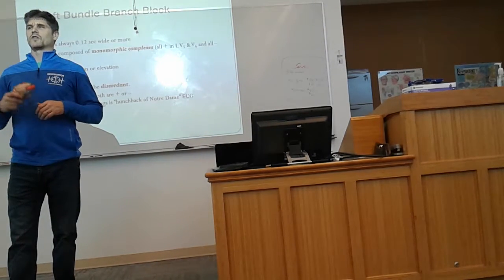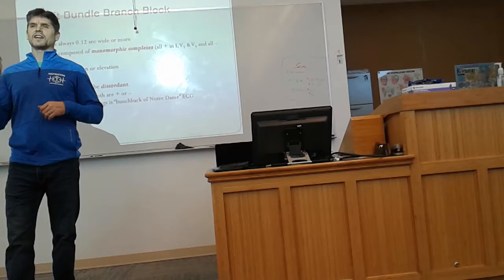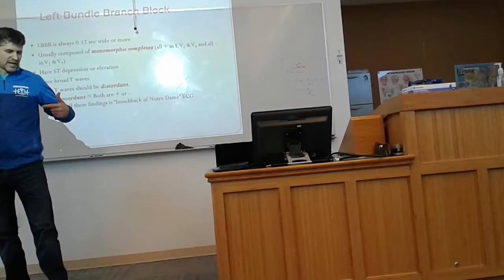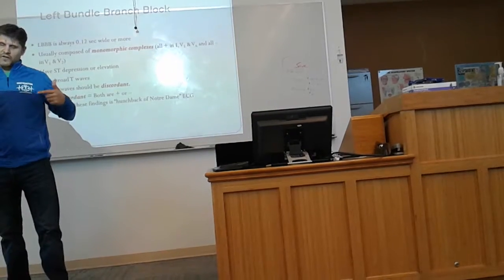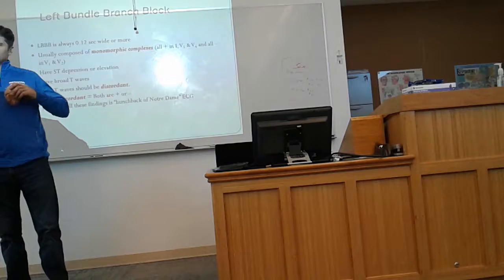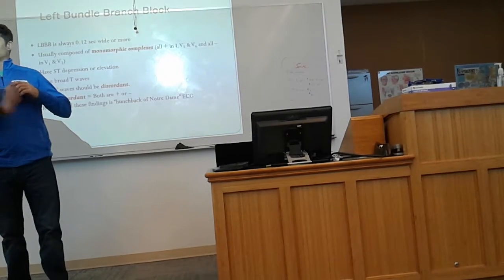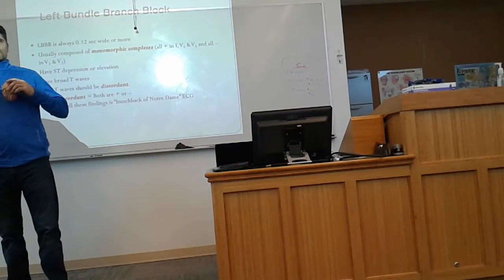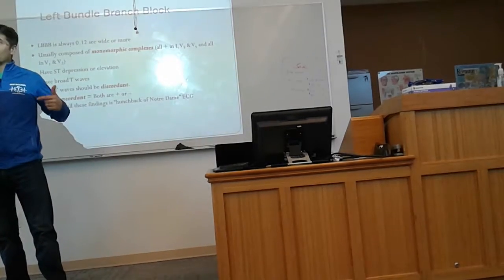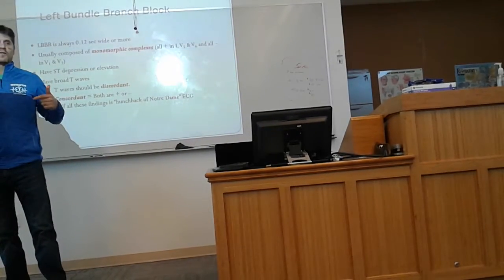Cell to cell. So where is the average majority of the electrical activity in the heart happening? On the left side. So leads 1 and V6 are over here looking directly at the left side where all of the electrical activity is traveling. Endocardium, epicardium, cell by cell, all towards the left, which means everything's going directly towards lead 1 and V6.